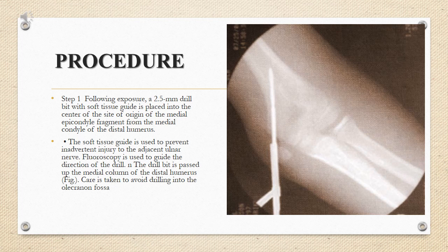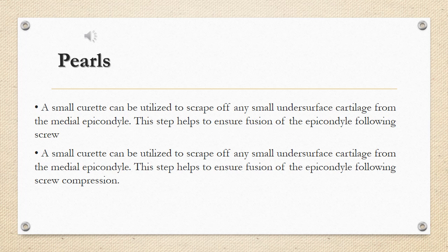Step 1: following exposure, a 2.5 mm drill bit with soft tissue guide is placed into the center of the site of origin of the medial epicondyle fragment from the medial condyle of the distal humerus. The soft tissue guide is used to prevent inadvertent injury to the adjacent ulnar nerve. Fluoroscopy is used to guide the direction of the drill. The drill bit is passed up the medial column of the distal humerus. Care is taken to avoid drilling into the olecranon fossa. A small curette can be utilized to scrape off any small undersurface cartilage from the medial epicondyle to help ensure fusion of the epicondyle following screw compression.